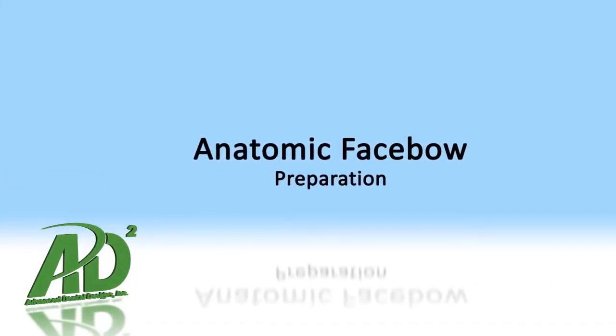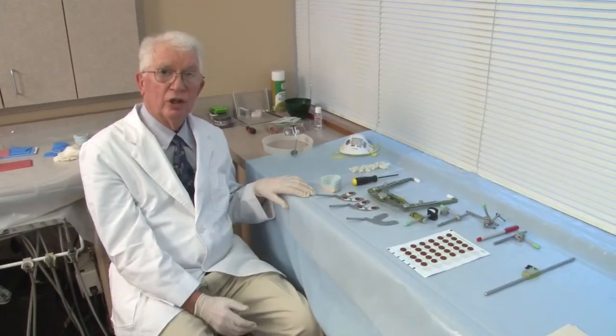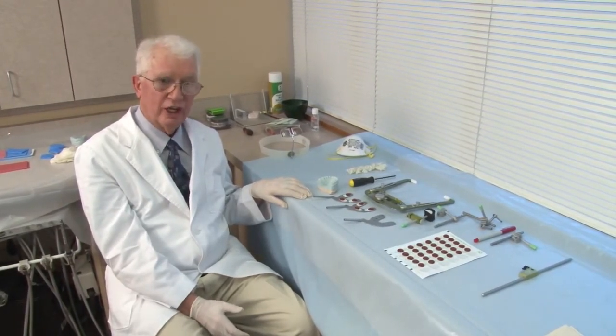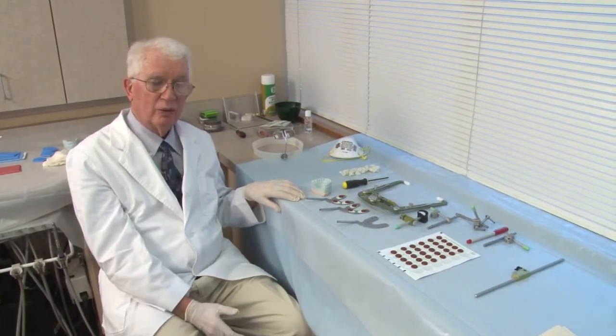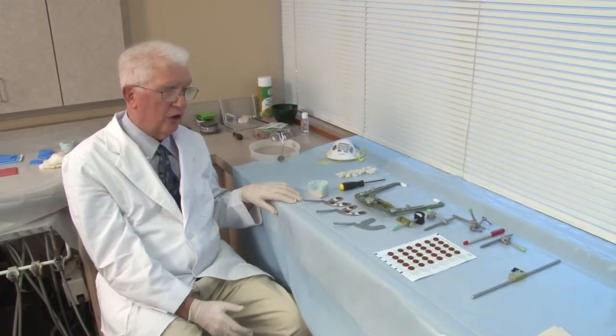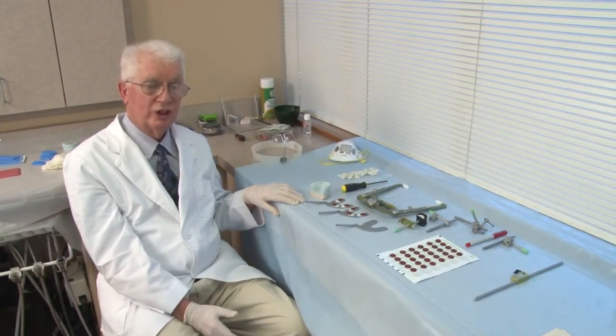Remember, in your office, your most important asset is your time. So you want to make a very, very efficient use of your time. And so if you've done your models and your wax bites the day before, then you can have all your instrumentation set up and ready to go the minute the patient walks in the door.